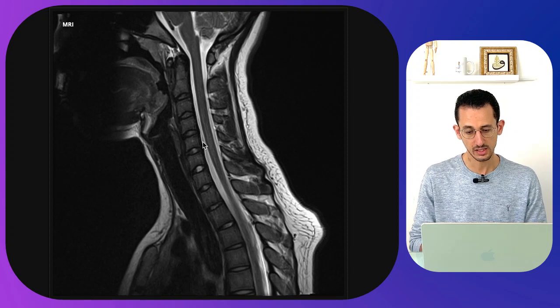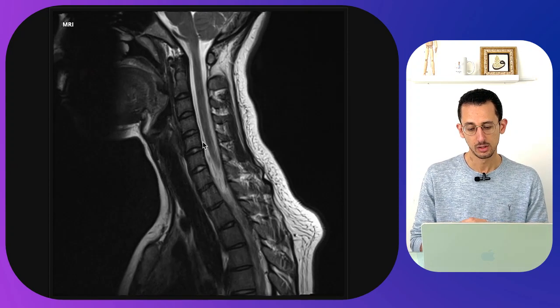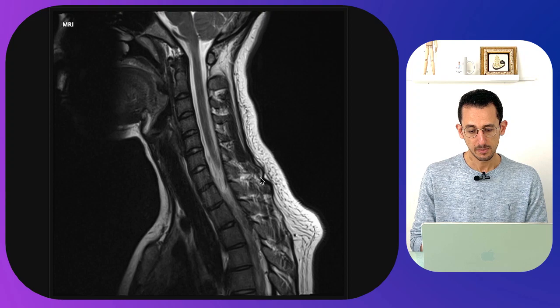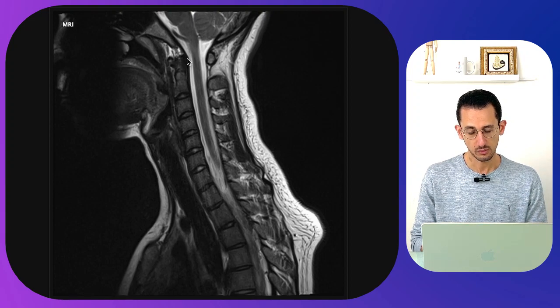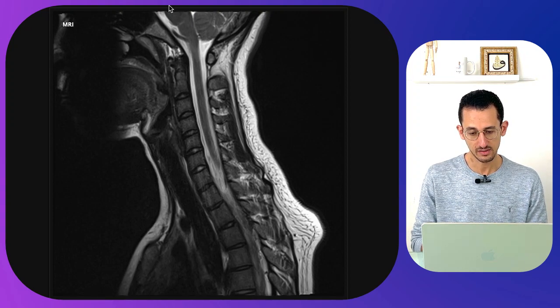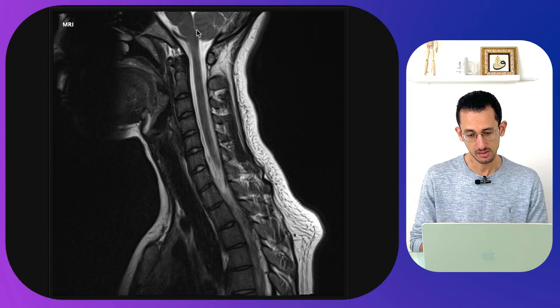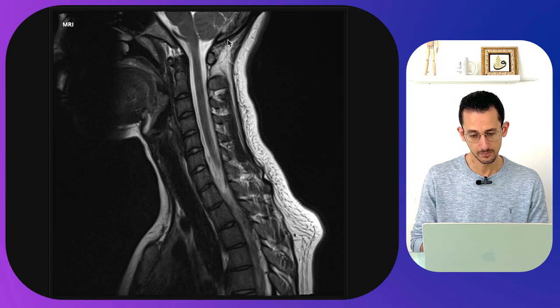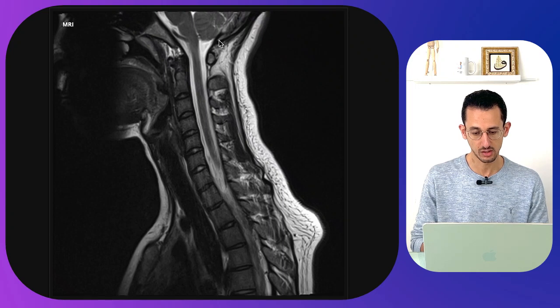Here we see a midline sagittal image. At the top is the brain stem and the cerebellum. This is the end of the brain stem around the foramen magnum. What we see here is the clivus, the posterior margin of the foramen magnum, and the cranial cervical junction.